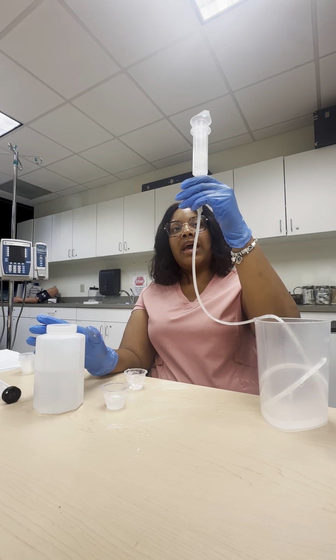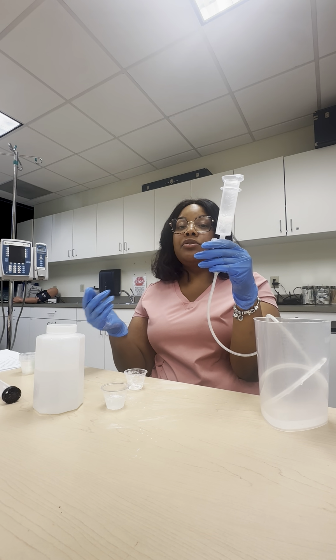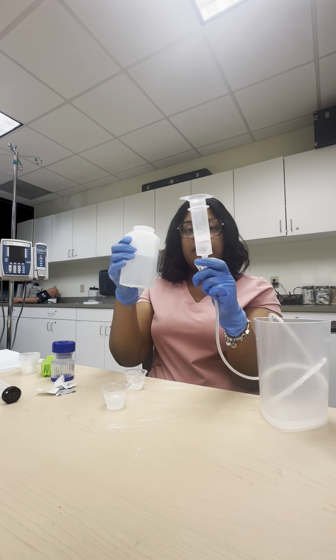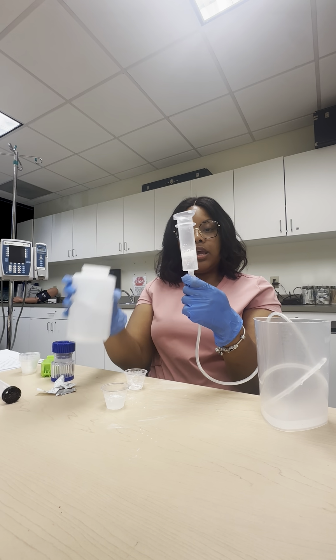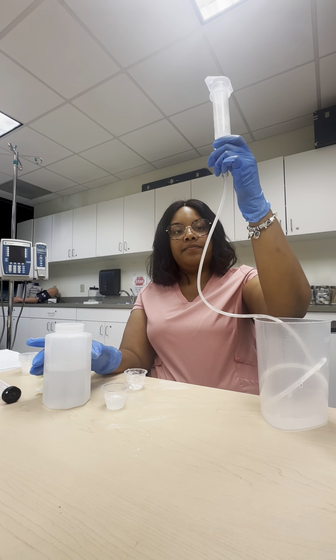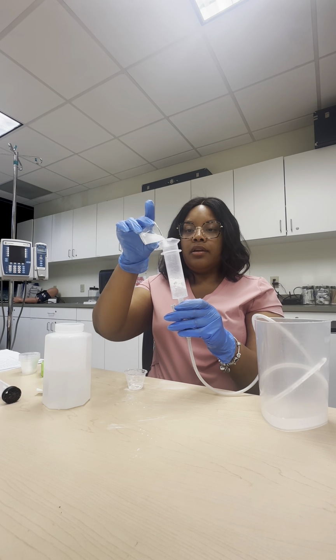All right, so we have one more medication to give. How many mLs do we need to flush in between medications? 15. What you can do is just look at the numbers on here, and you can see 15. Then we're going to hold it up, and that's going to be the water flush. All right, so then let's give our last medication.